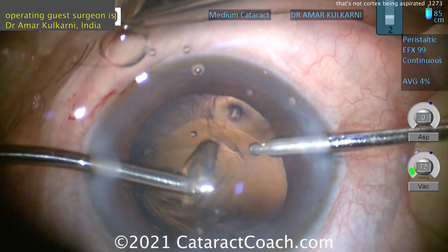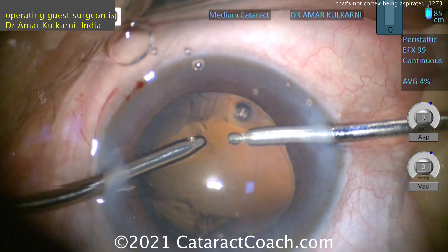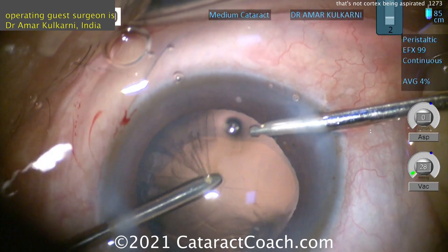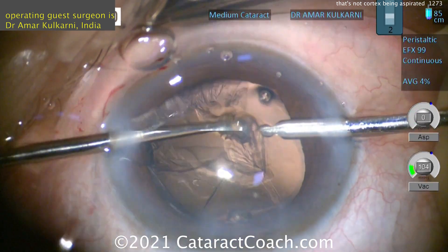So do the cleanup here on the areas that have better support. Then that one area — which is the inferior part of your video screen — maybe we can leave a little bit and come back to do it after we get the CTR in. But be very cautious pulling too much in that area.